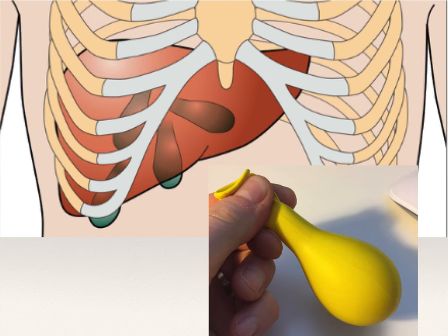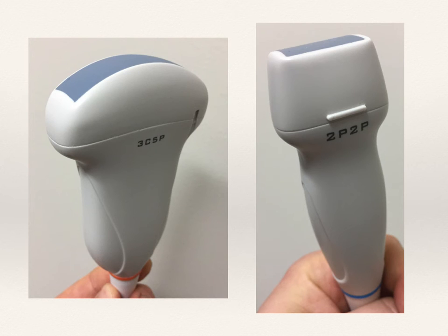When we're going to look for the gallbladder, we have a couple of probes that we can choose from, depending on the patient's habitus, our comfort, and a number of other factors. The two that we generally look to are the curvilinear probe shown on the left, or the phased array probe shown on the right. For the most part, the curvilinear probe will be the better probe to use. It has a larger scanning window when we're looking at the relatively superficial gallbladder. However, there will be cases where you can't easily see the gallbladder, and you need to take an approach that isn't so much subxiphoid or subcostal, but between the ribs. In that case, it may be more beneficial to use the phased array probe.